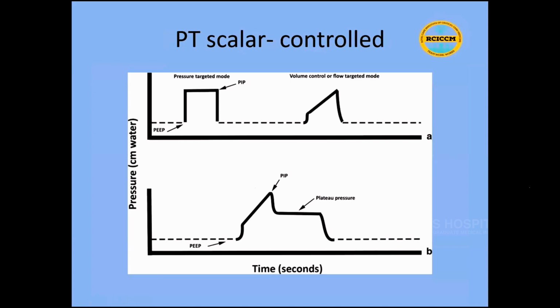So a brief mention about the pressure time scalar. Let us have a little bit of a detailed look now at the pressure time scalar. So this is how a pressure time scalar would look like.